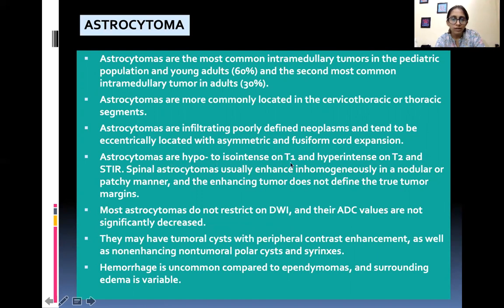Astrocytomas are hypo-to-iso intense on T1 and hyper intense on T2 and STIR. Spinal astrocytoma usually enhances inhomogeneously in a nodular or patchy manner, and the enhancing tumor does not define the true tumor margins. Most astrocytomas do not restrict on DWI and their ADC values are not significantly decreased. They may have tumoral cysts with peripheral contrast enhancement as well as non-enhancing non-tumoral polar cysts and syrinx.